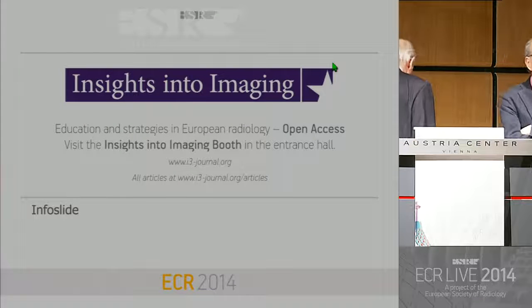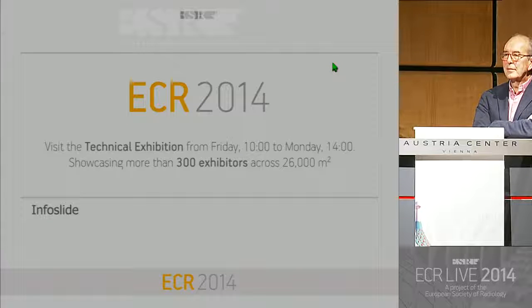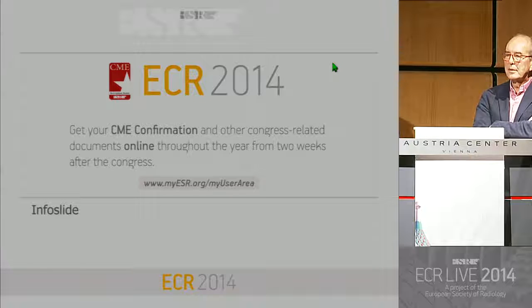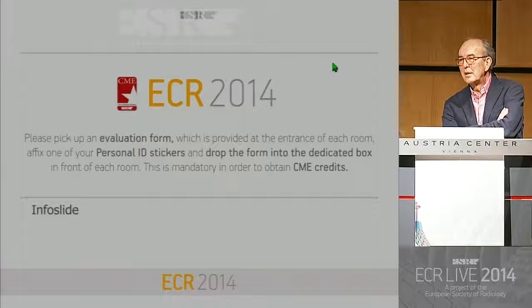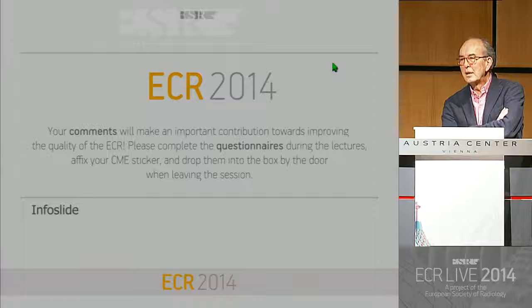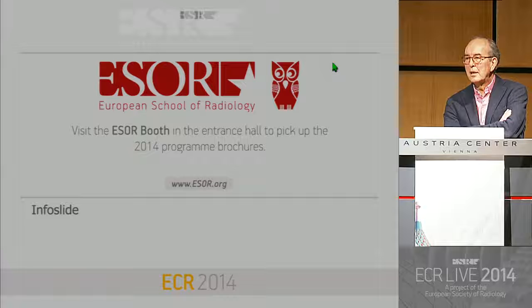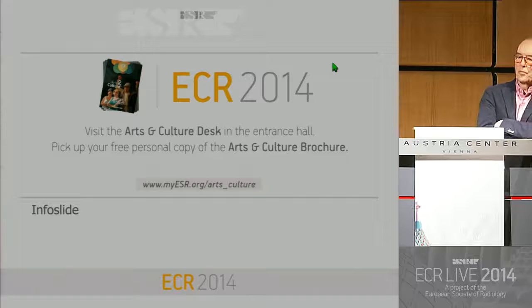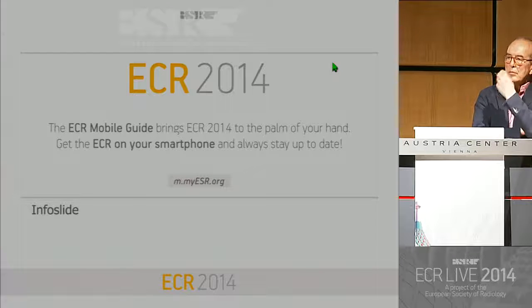Okay. Thank you. New York isn't the UK either, and NICE just published in January a 468-page heavyweight document on revision and prostate cancer, and we recommended for active surveillance that every man who has biopsy-proven prostate cancer and has been submitted after discussion to active surveillance has an MRI at 4 to 6 months to avoid the post-biopsy hemorrhage problems. So that's going to pretty much inform what will happen for the whole of the UK, which is about 30 million men. So we should have some data from that.